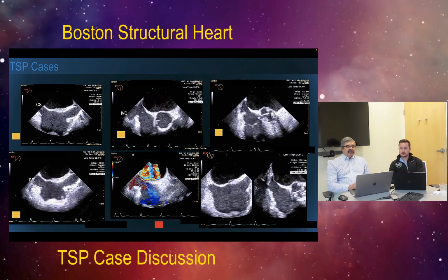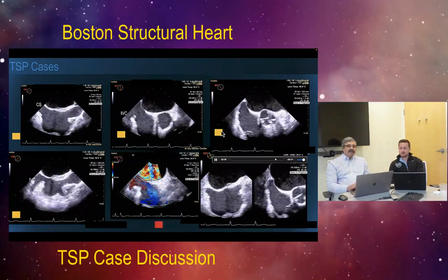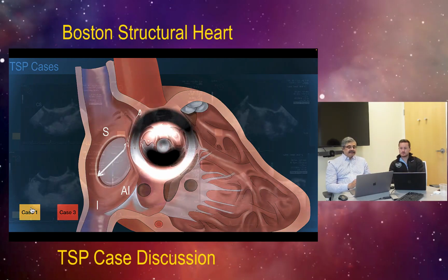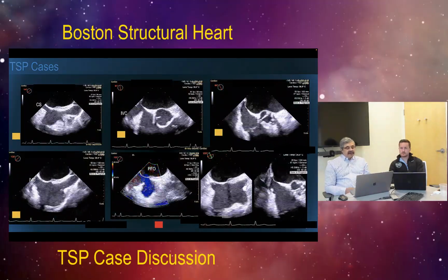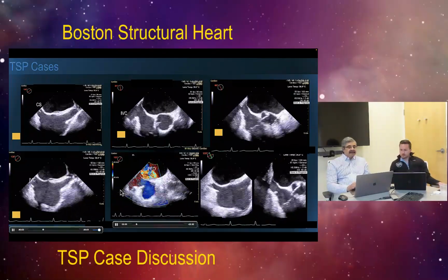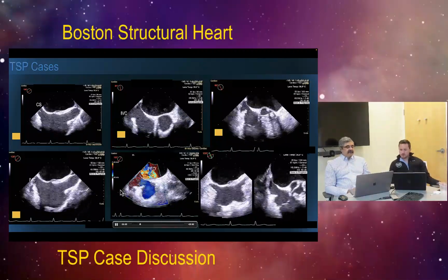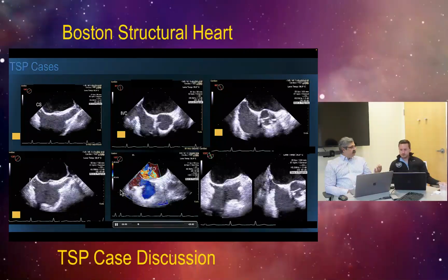And then that goes on to give us the modified kind of a five to four chamber view in this specific patient, again giving us the anteroseptal to the inferior view of the intraatrial septum. Now, having said this, you can see that this patient also had what seems like a little patent foramen ovale over here. Would you agree with that? You can see, well, the scale is not exactly set, but the problem with this one is that when the patient has a patent foramen ovale, the needle has a tendency to cross the path of least resistance.